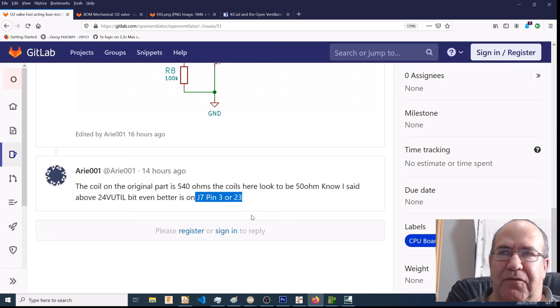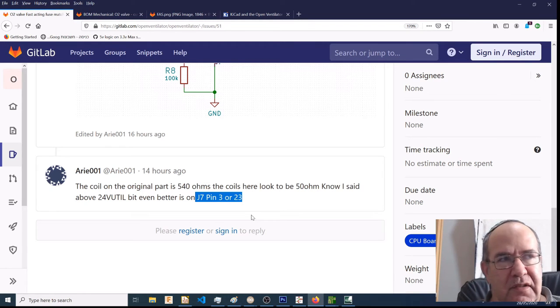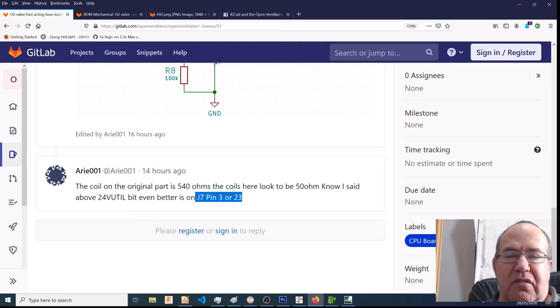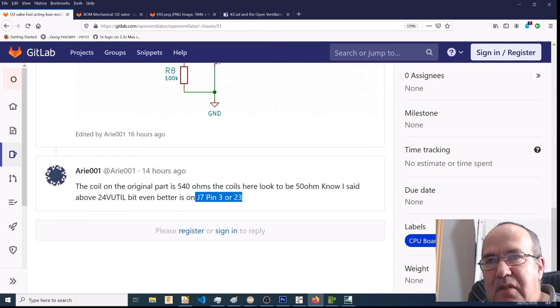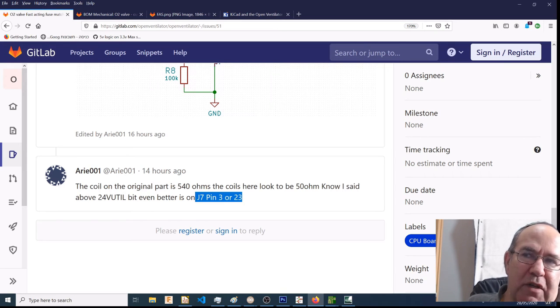So 14 hours ago my comment was the original part had, I'm not sure if it's a 540 or 140 ohm coil, because there are two versions of this, that would have less current. And here the replacement coils have 50 ohms. So 50 ohms on 24 volts is about 500 milliamps. So I was saying that you're better off taking it off 24 volt util, or use J7, pin 3, or pin 23.